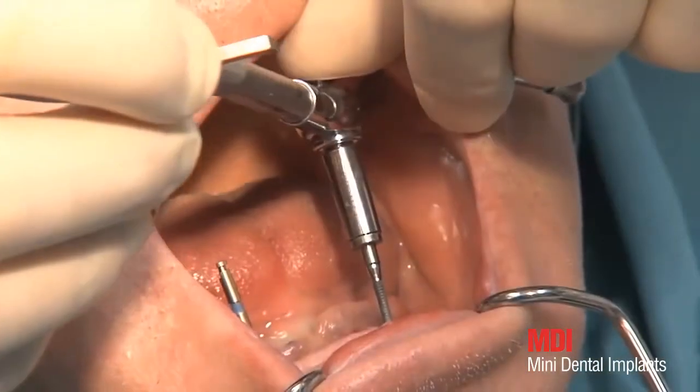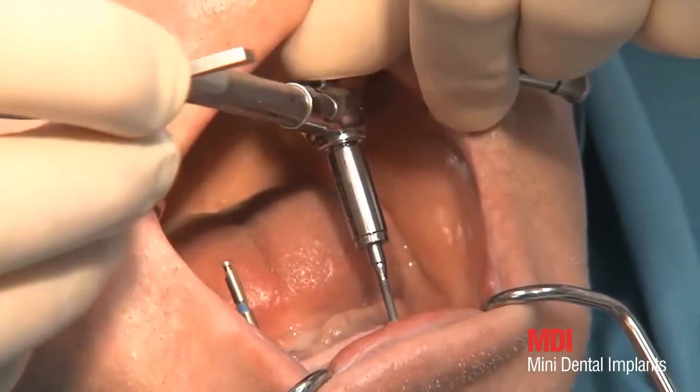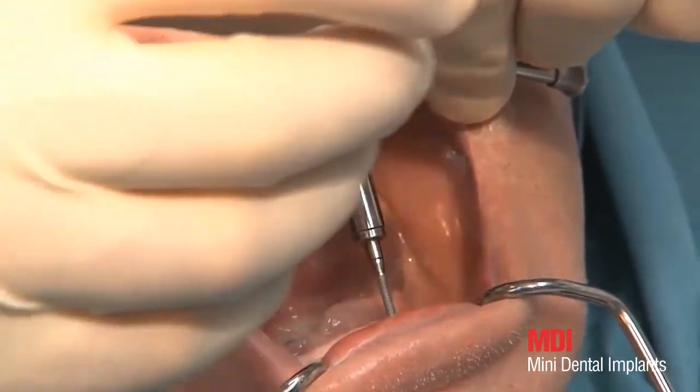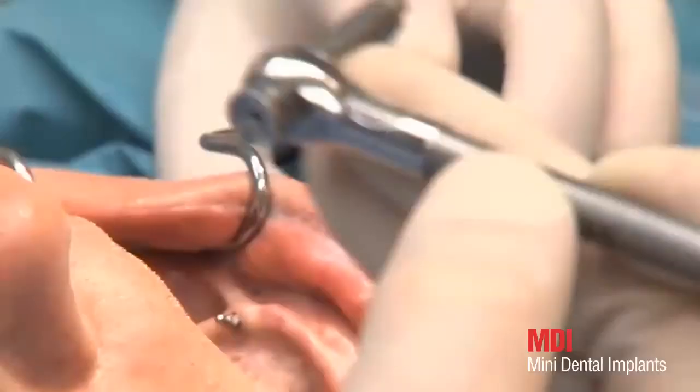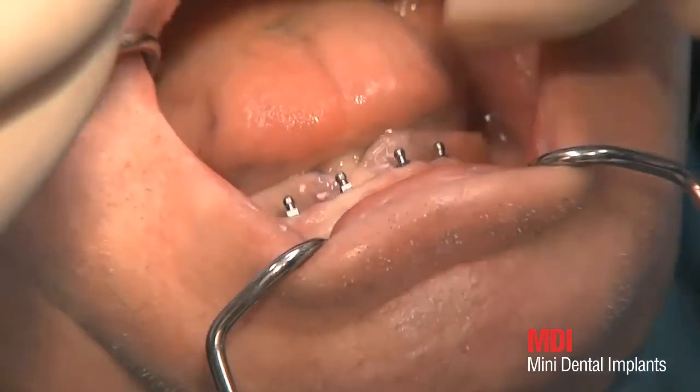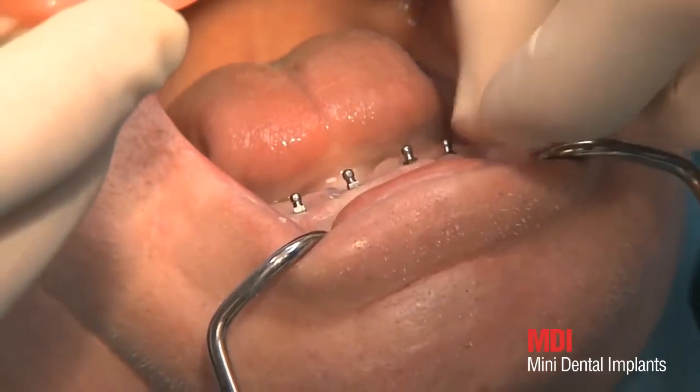In order to receive primary stability for immediate loading, 35 to 45 newton centimeters are needed. The wrench head must be stabilized with a finger in order to prevent shearing forces as a result of tilting. The rest of the implants are set in the same way as described before.